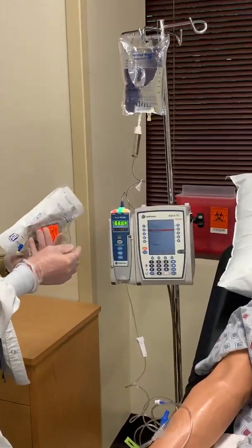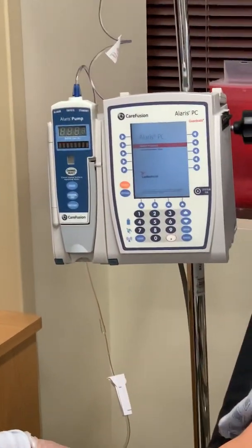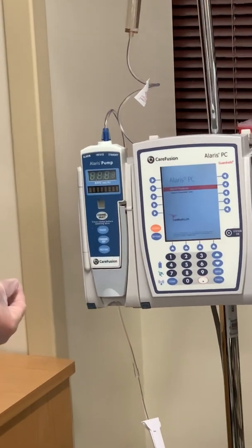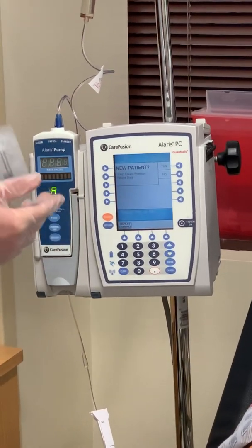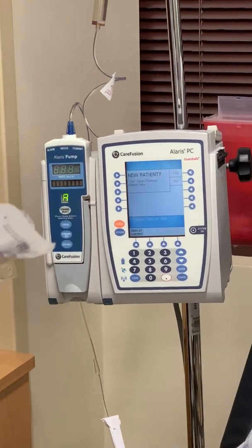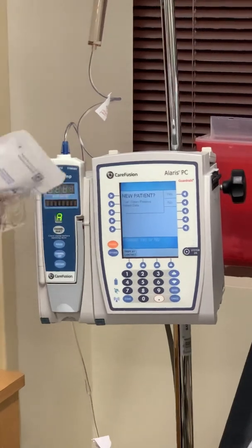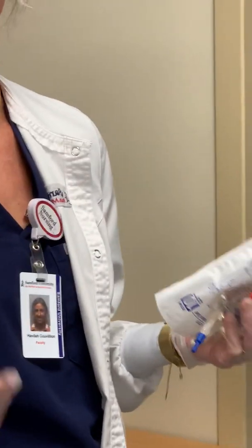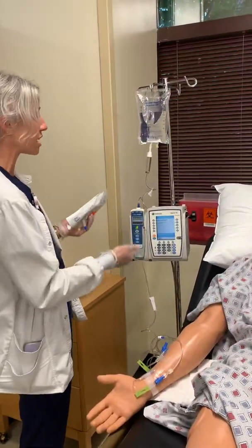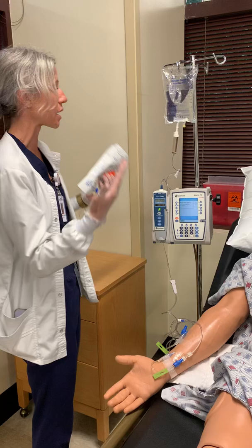Making sure that my pump is on. Sometimes this will take a minute. Now, one thing you guys want to be mindful of: let's say that he went to the bathroom and came in and his pump was off for some reason. Always make sure that if it's off, that it's supposed to be off. You're going to laugh, but that happens all the time. You'll come in and the pump's off, but he's supposed to have fluids running. So, oh no, he's supposed to have fluids running, and I realize that.